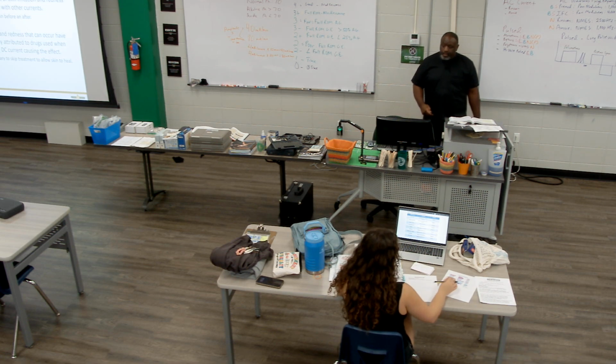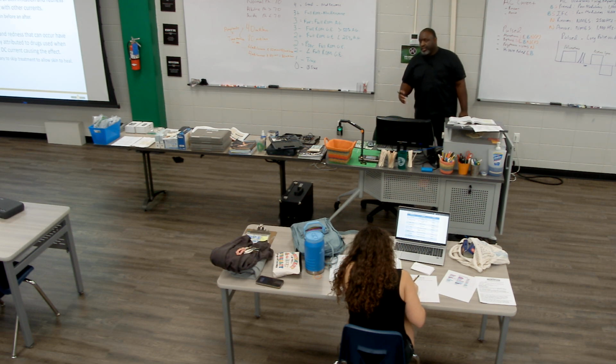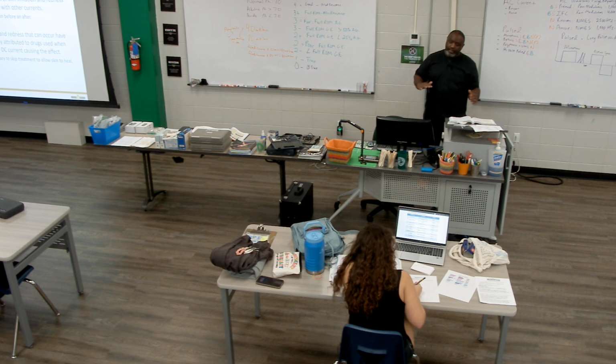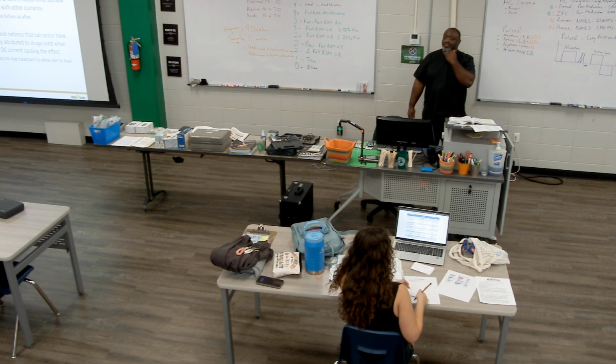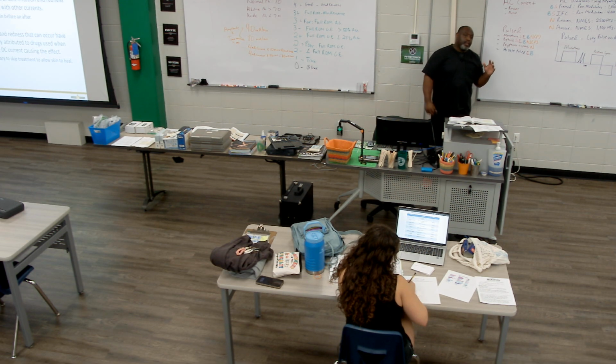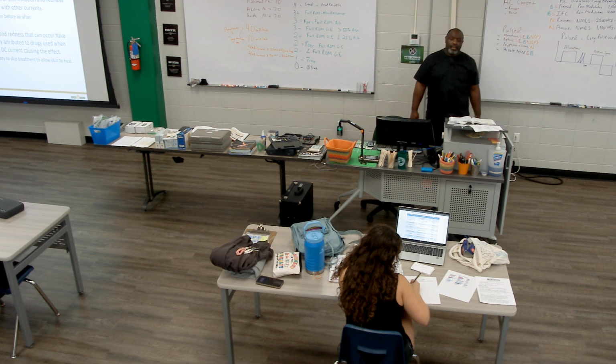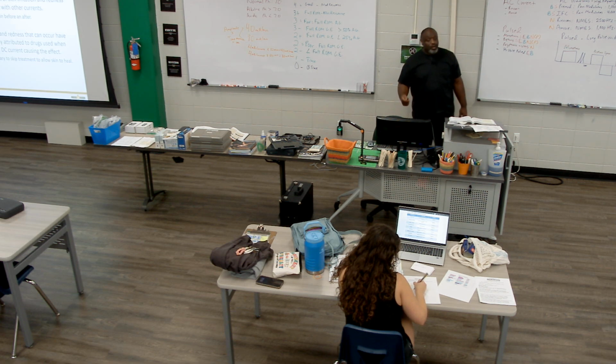Okay? And this isn't a treatment I do on back-to-backs. So if I see a patient two days a week, I'm only iontophoresing one of those days. I give the skin a break. I don't want to overload the skin with this. If I see them three times a week, I maybe will do it on a Monday and a Friday. But I'm not doing this back-to-back days, and I'm not doing this more than two days a week because of all of the effects.